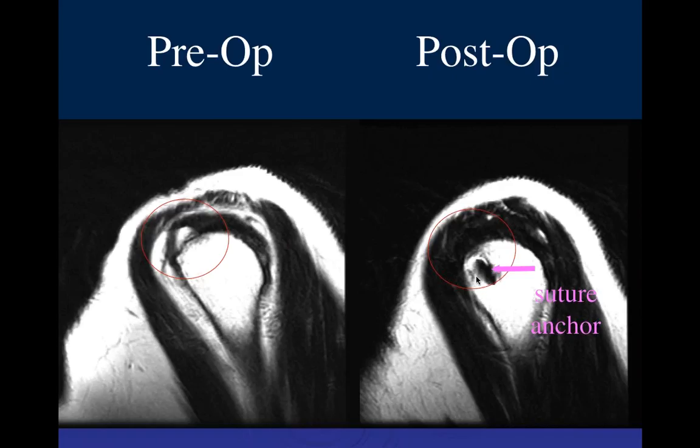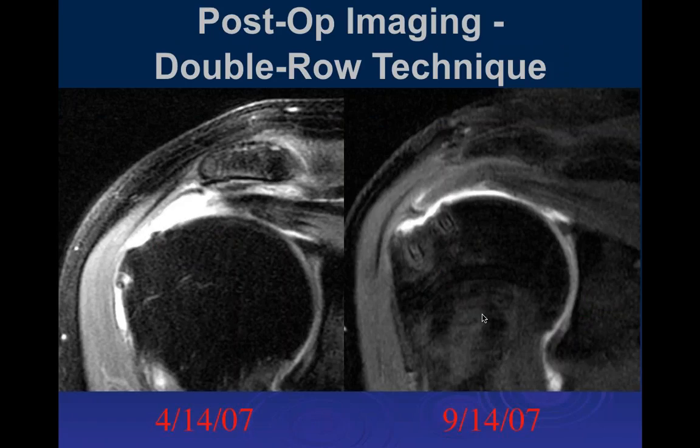And there are a lot of different kinds of suture anchors. We were talking about that before. Some metal, which are less expensive, some which are resorbable, which tend to be more expensive. So there's often a fight with the insurance company as to which kind you can use.